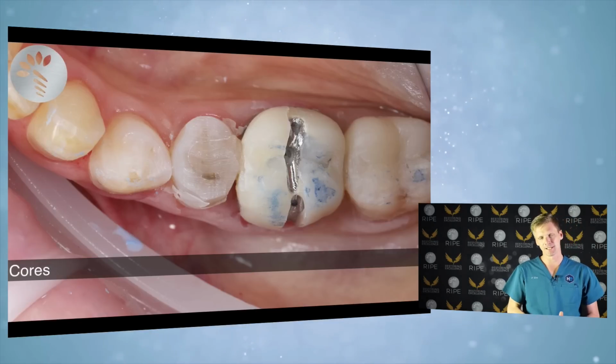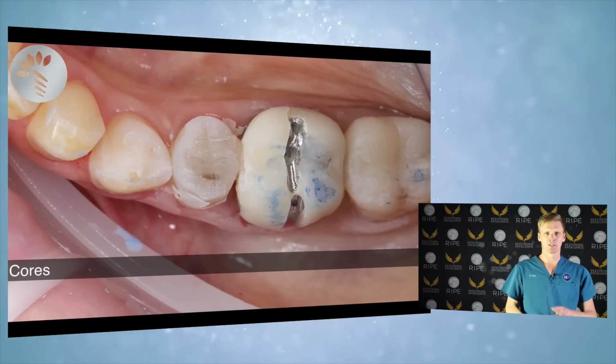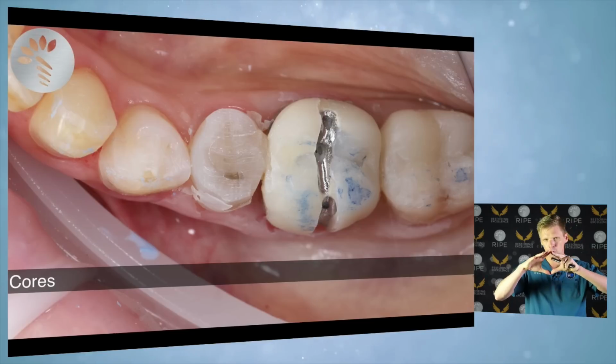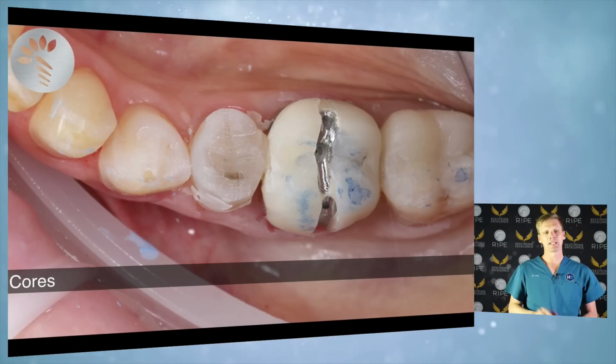Now, I'm not going to go over anaesthesia totally in this particular webinar, but there is a whole section in the online lecture which goes for a couple of days, which I'll talk about at the end. So to get the impression correctly, we need to have a core that is smooth, and that's because of the wettability of silicone, the contact angle with the tooth. And I'll explain that a little bit in a moment.